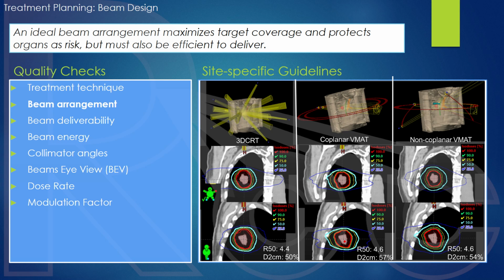It may be that there is an advantage from using a longer rotation, 360 degrees. I think Dr. Lin could talk about that. There may be other cases where we have multiple arcs, some of which are 180, but then we have some of which are shorter, and that's used for organ avoidance or to avoid collisions.